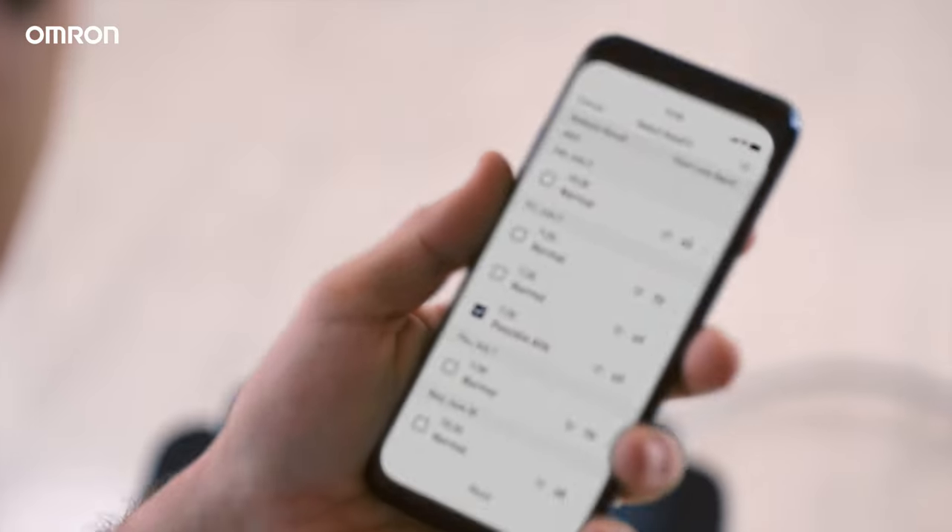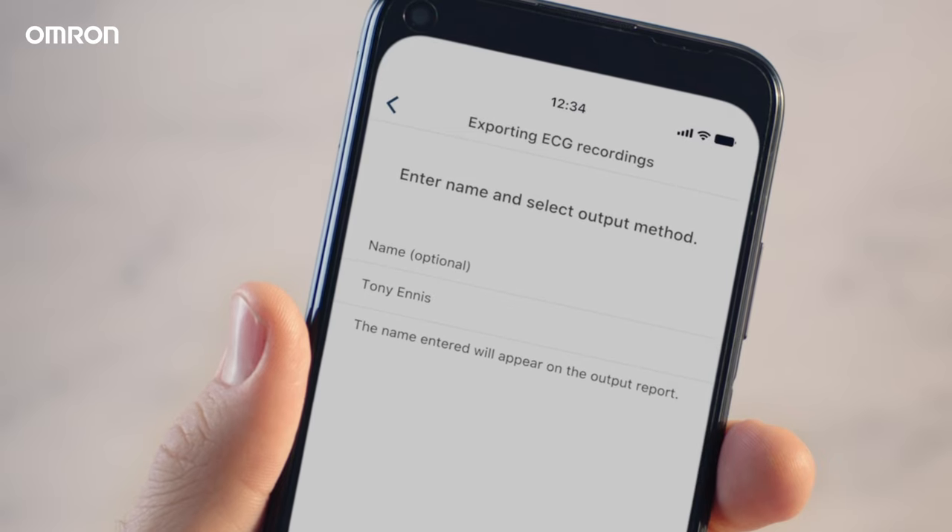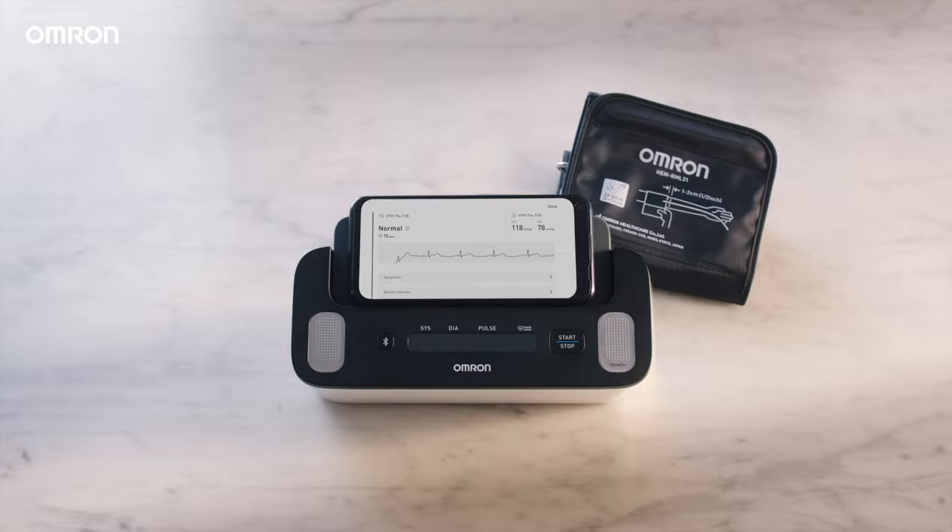You can even track your results over time or share them with your doctor. Blood pressure and ECG? Now. That's complete.